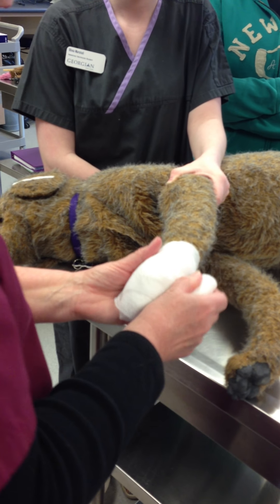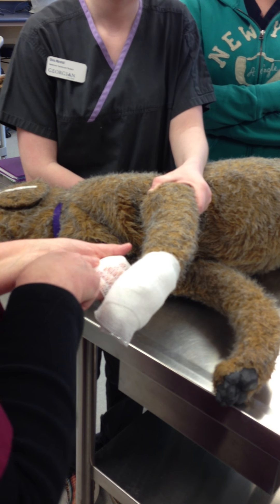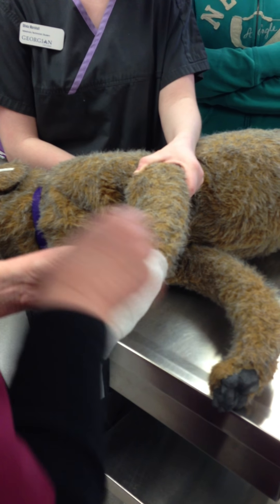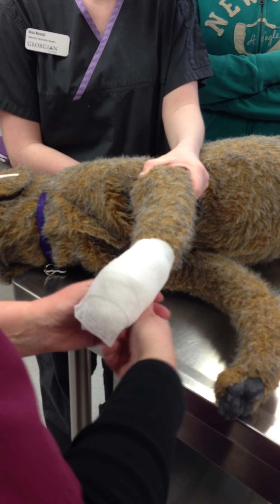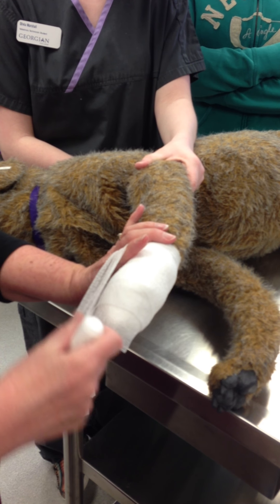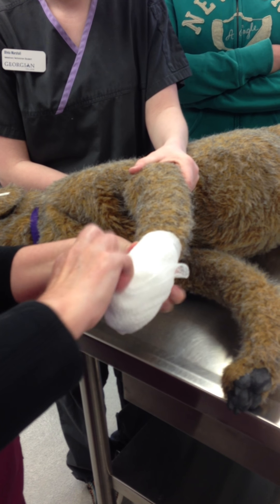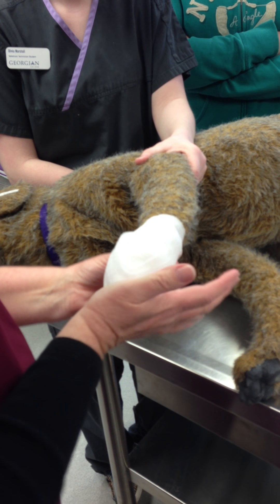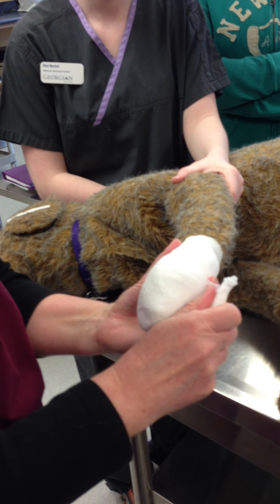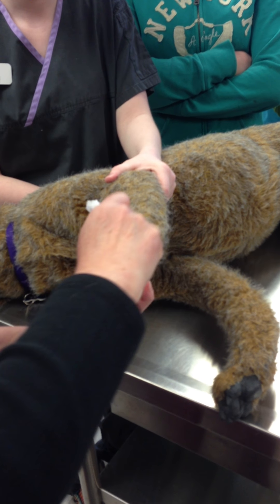Another bandaging convention is when you're putting your bandage material on, these rolls are designed to be unrolled around the paw. When you're doing a dog or a cat, there's not that much — it doesn't take you that long, it's not that big a bandage. But when you're doing an equine, it takes you a while. So then back and forth again so that we've got lots of padding over the toe, and you can do a little bit of a figure eight on the toe to make it nice.